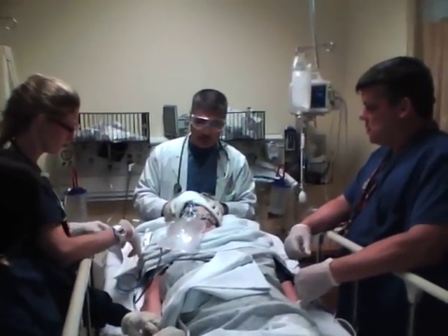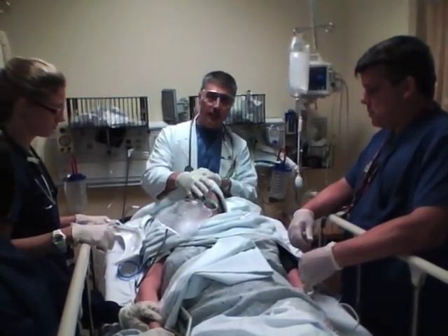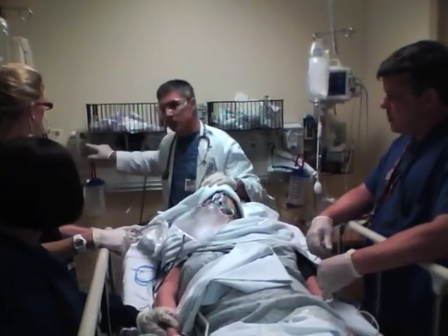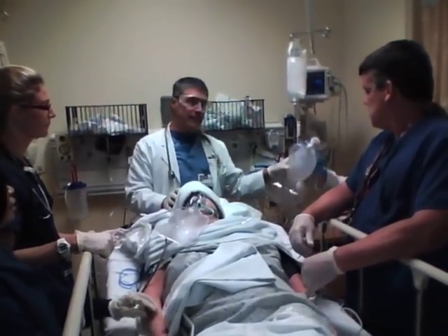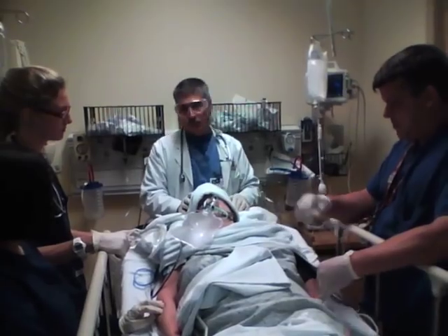In preparation for the intubation, you need to make sure that the entire head of the bed is ready to go. That includes a 100% non-rebreather on the patient, suction set up so that you can suction the patient — suction should be turned all the way up to full and should not be on intermittent. You also need a bag-valve mask set up with airflow into it. The capnometer needs to be set up and calibrated so that we know when the tube is in.